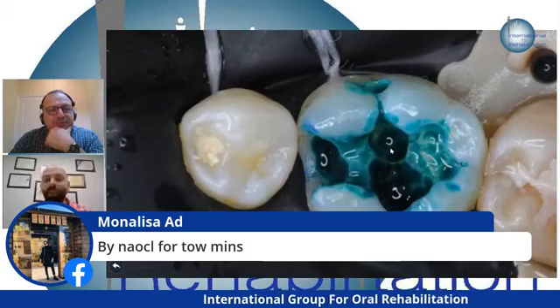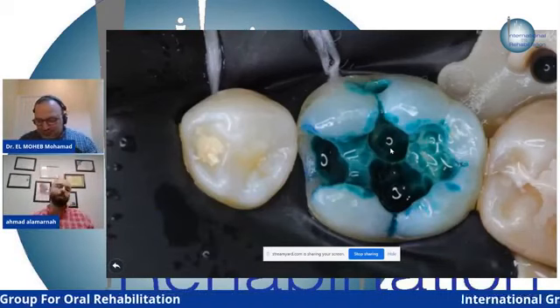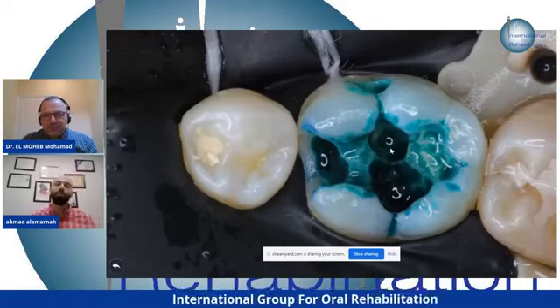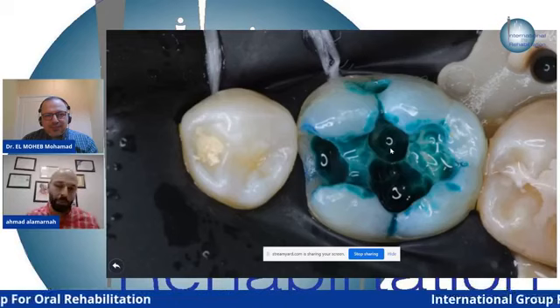NaOCl for a few minutes. Me, 100%. The sodium hypochlorite. I soak the cavity with sodium hypochlorite to remove any bacterial byproducts.